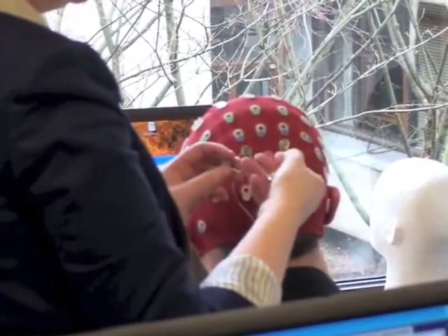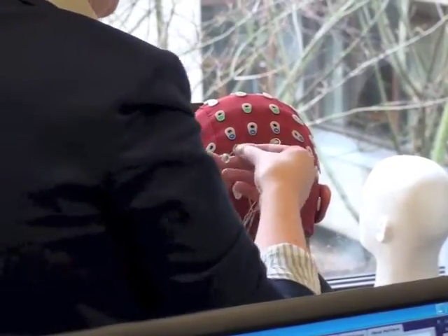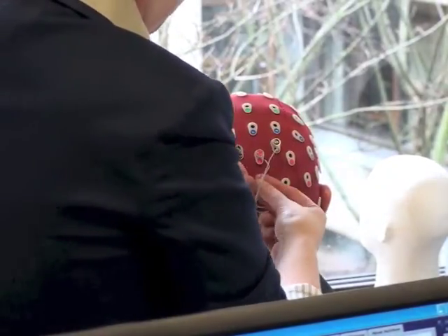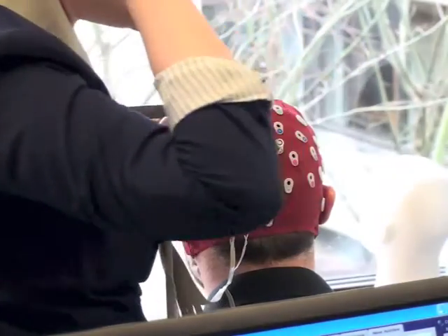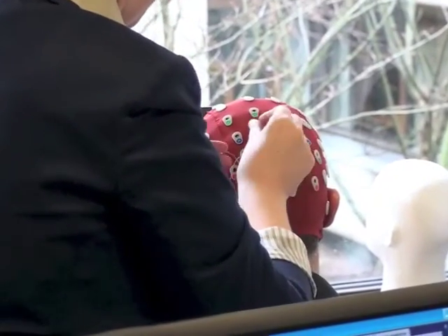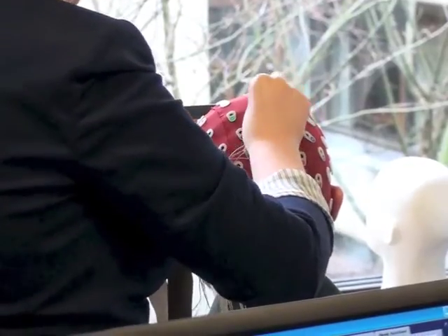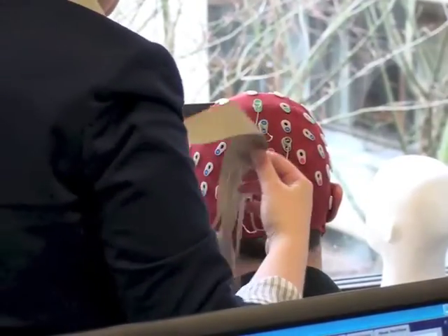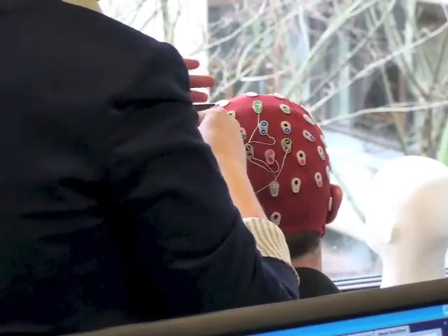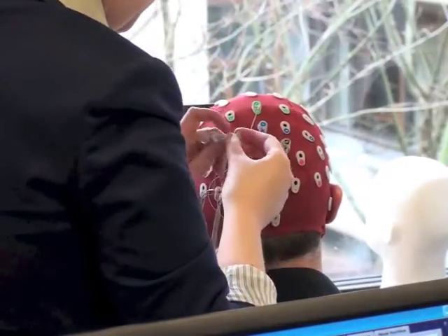I'm saying the cap's not that tight on him, and his head is 3 centimeters larger than the recommended size for this. So you can see that it's hard. Plus, people have different size heads. Some people's heads come out more here, and the cap allows for people's heads to come out more at the back. So it's just tough sometimes with people's heads. There's nothing you can do.